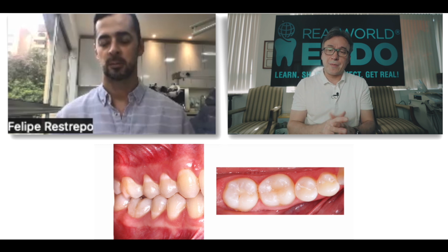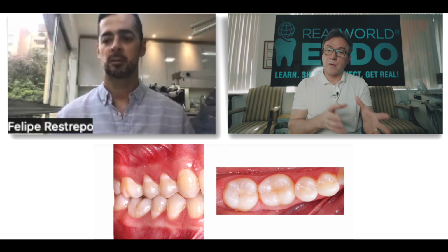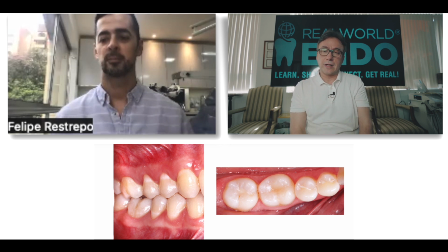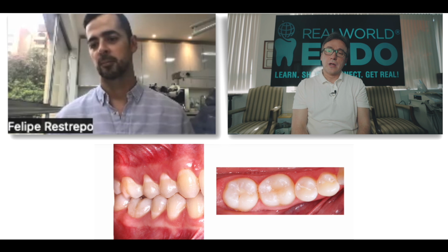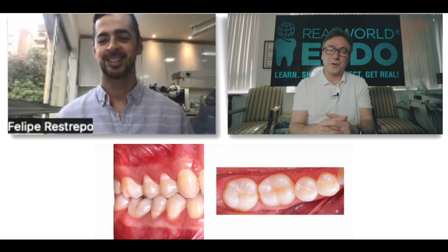Here you use dynamic navigation to get a fairly close approximation of the shape of the tooth from that which you printed into the bone, so that it ends up being a very close match. But alternatively, if you don't have access to that, you're going to have to use a little bit of good old school, just touching and trial and error with your printed tooth.